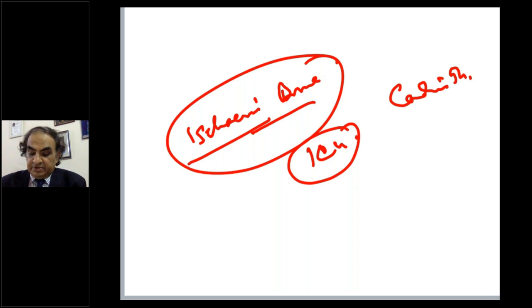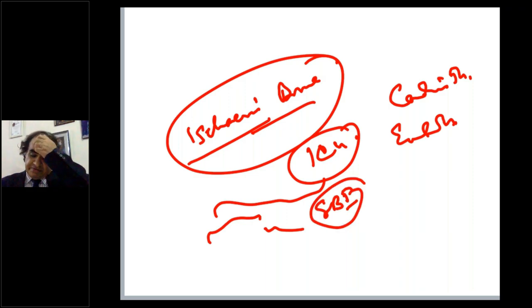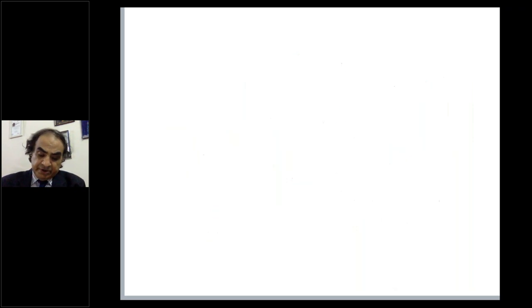They can have emboli, which can be showered into the gut. You can actually find small bowel ischemia. Very important finding. And you can also see whether it's arterial or venous. So that's also additional.